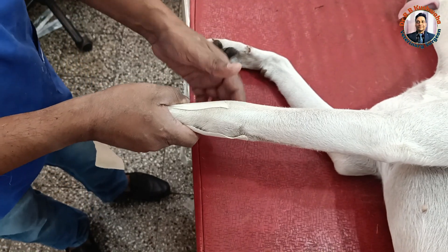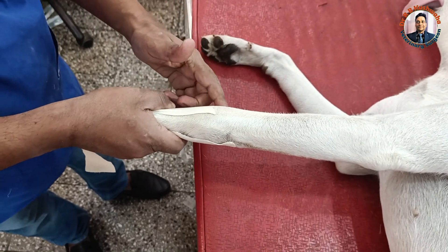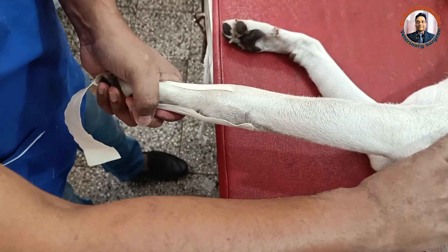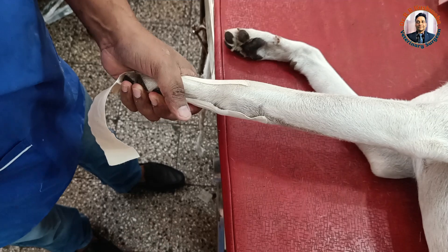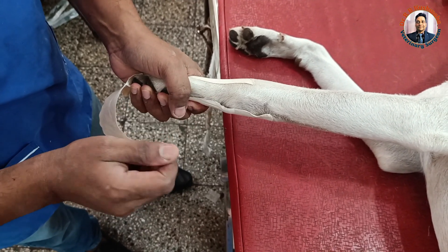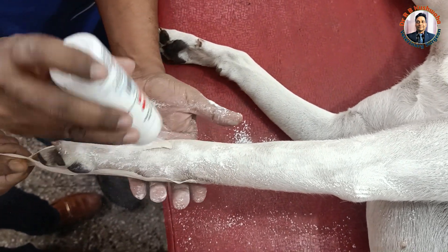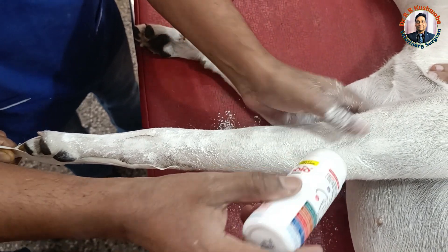We have reduced this fracture fragment — that is the closed reduction. We have reduced this fracture by the closed method. Now we are going to apply co-trimoxazole powder and then simple bandaging, which acts as a stockinette. Because we don't have stockinette, instead we apply a cotton bandage. If possible, we apply boric acid or this co-trimoxazole dusting powder.